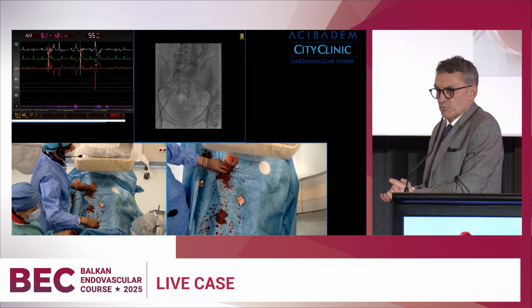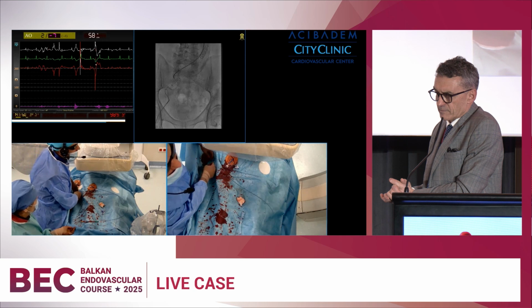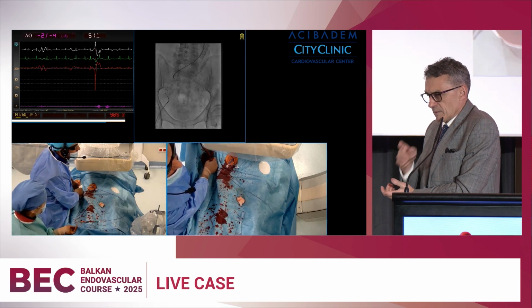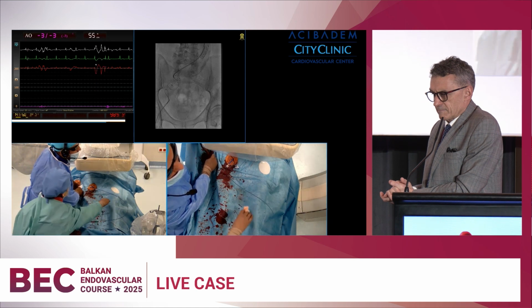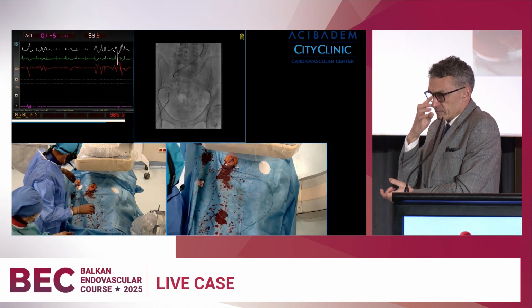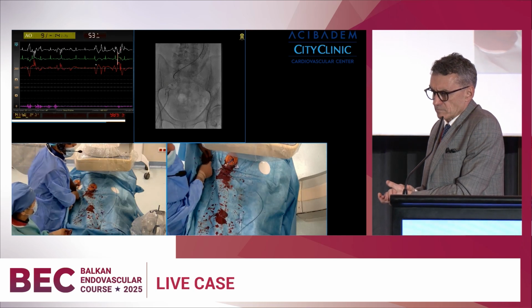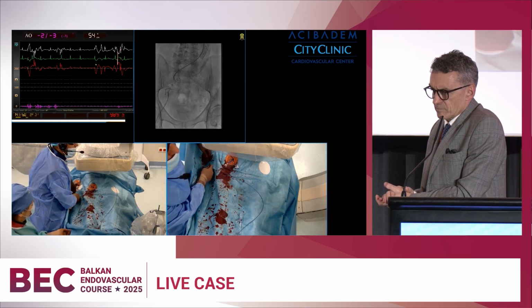Yeah, it's push and pull, back and forth. Now it's in a better position.